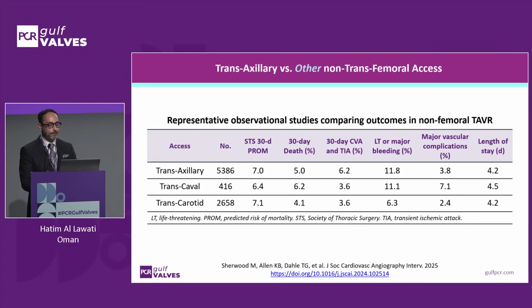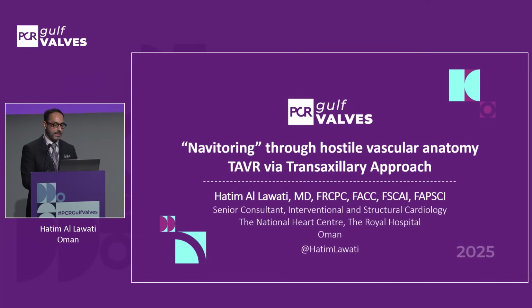This was another analysis from a series of observational studies comparing outcomes in non-femoral TAVR stratified by transaxillary approach, transcaval, and transcarotid approach. And albeit transaxillary approach had a higher risk of CVA and TIA at 30 days, there was no increase in the risk of 30-day mortality or length of stay, and no other access site complications noted. So transaxillary approach remains a viable option, particularly when we're dealing with hostile femoral anatomy for transcatheter aortic valve implantation.